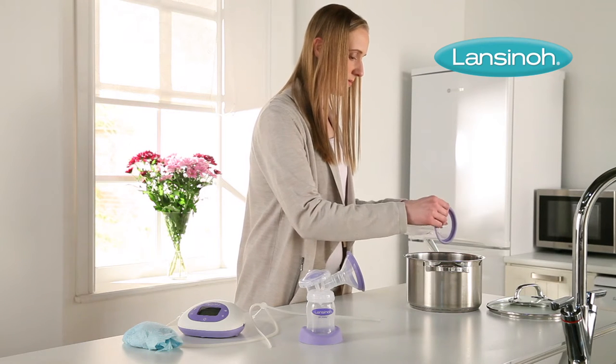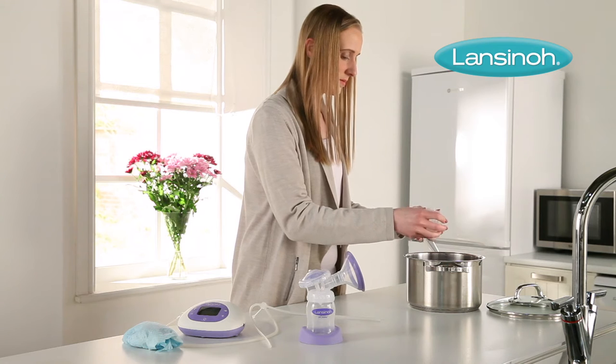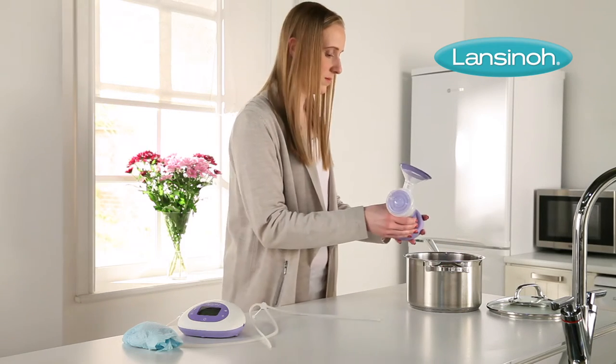To sanitize the breast pump before using it for the first time, take it apart and boil all of the parts that come into contact with breast milk for 5 minutes. Do not boil the pump base, plug, tubing, or tubing connectors.